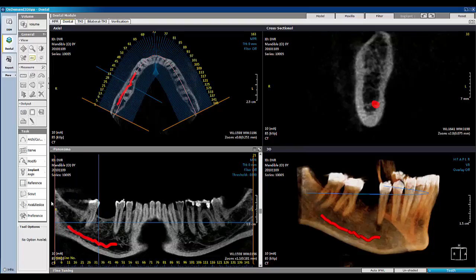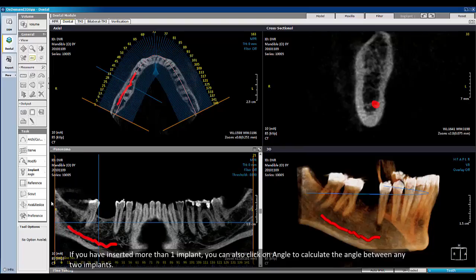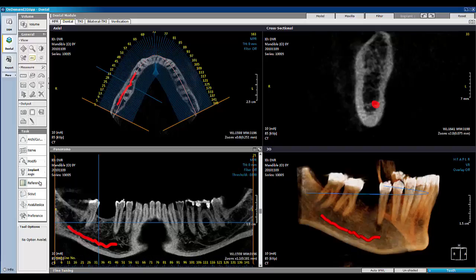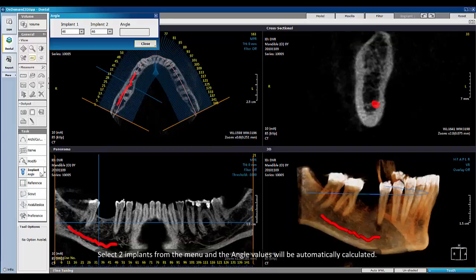If you have inserted more than one implant, you can also click on Angle to calculate the angle between any two implants. Select two implants from the menu and the angle values will be automatically calculated.